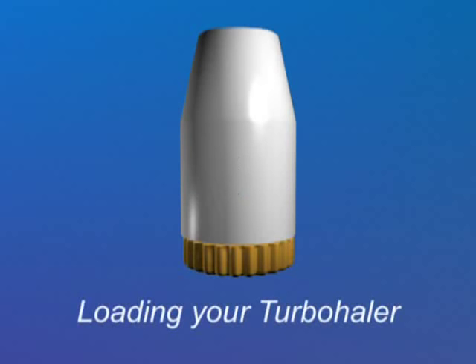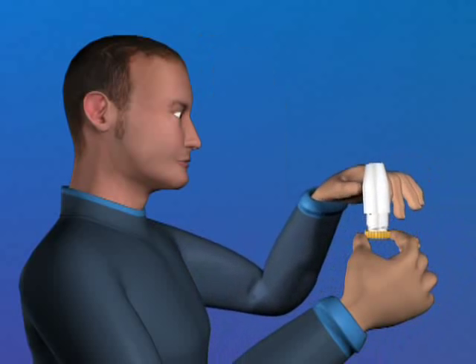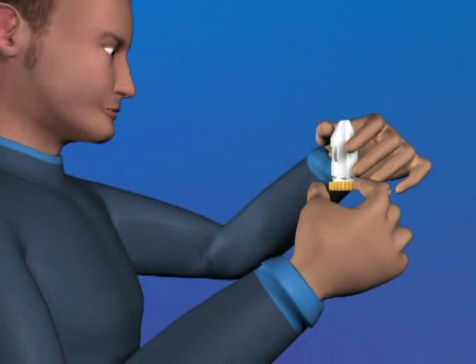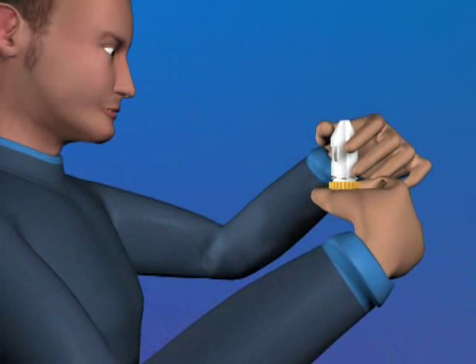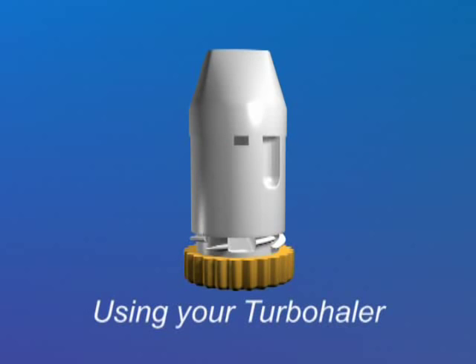Before you can use your turbohaler, you need to load it. To do this you need to unscrew the cover and lift it off. Hold the turbohaler upright in one hand. Then with your other hand, twist the grip fully in one direction as far as it will go. Then twist it back as far as it will go. You should hear a click. You have now loaded the turbohaler and it is ready to use.